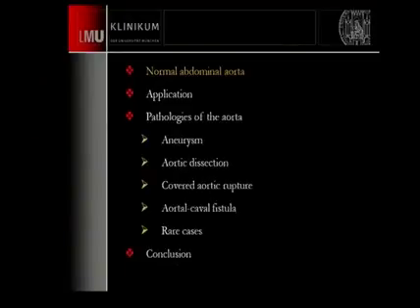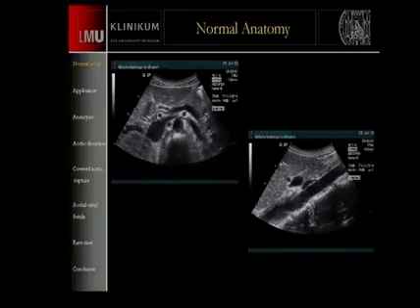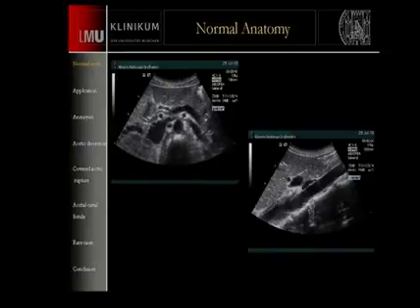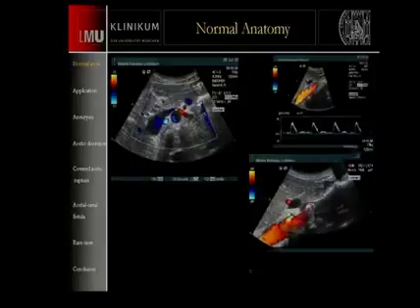Starting with the first image, the question is whether we really need contrast-enhanced ultrasound every time. If we look at the anatomic area, the aorta, we start with a grayscale image. In this image, everything is clear. We see no plaques, no moving membrane, so no aortic dissection, no aneurysm. Also on the longitudinal view, we see this nice shape of the aorta. So in this case, there is no need to use contrast-enhanced ultrasound.